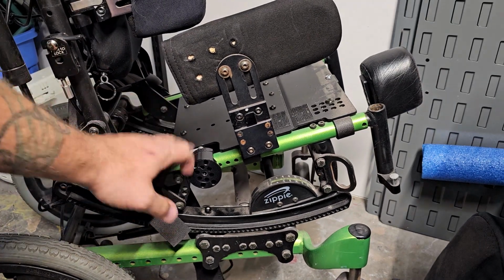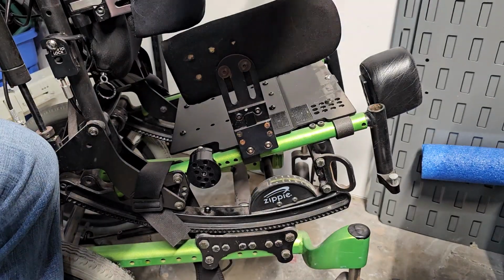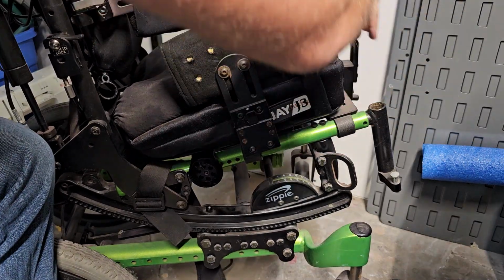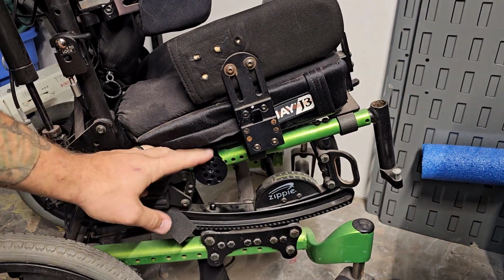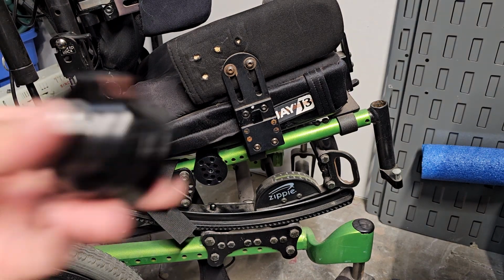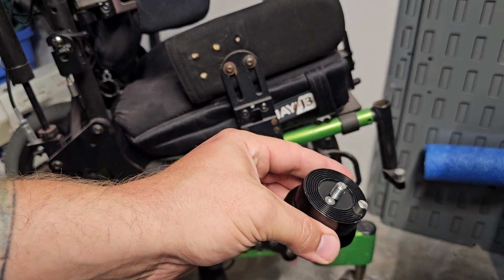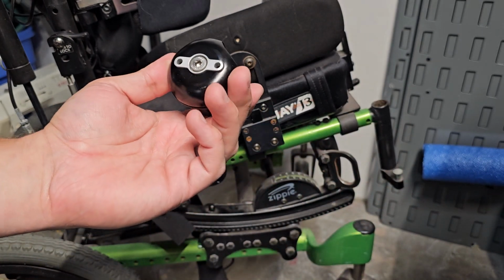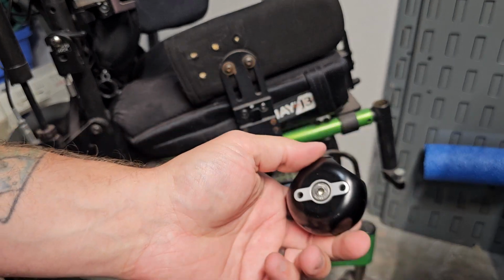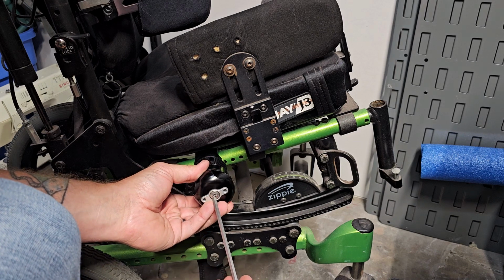Now that you got this mounted, and this is the part that I always leave on, I'll put the seat back on. And it'll look like this. Now what we need is the part that looks like this for mounting the pipe to the bracket. This here, this bolt does not come out, and this bolt is what mounts the bar to the wheelchair.